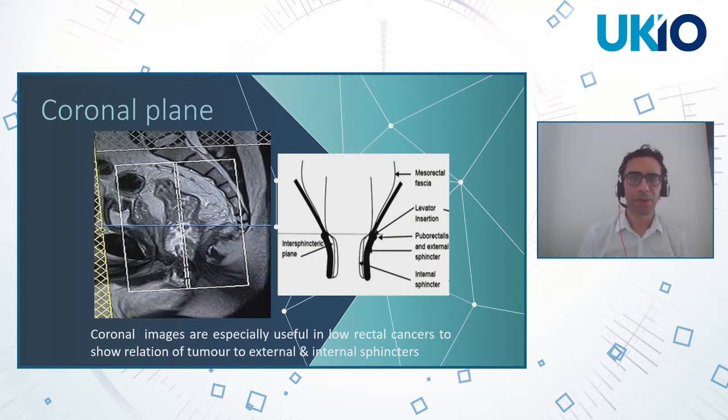If a low rectal tumor has invaded through the bowel wall into the intersphincteric plane, seen on the simplified line drawing, or extends through the intersphincteric space into the external sphincter, then if a total mesorectal excision is carried out, this will likely result in a positive margin. Such cases are considered by the colorectal MDT for chemoradiation or wider extralevator excisions.